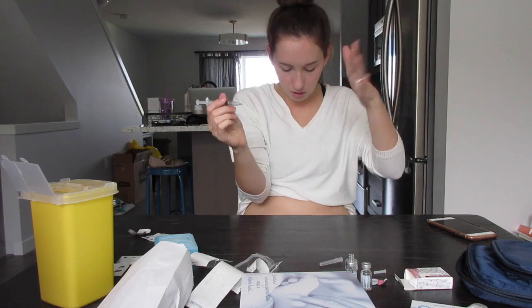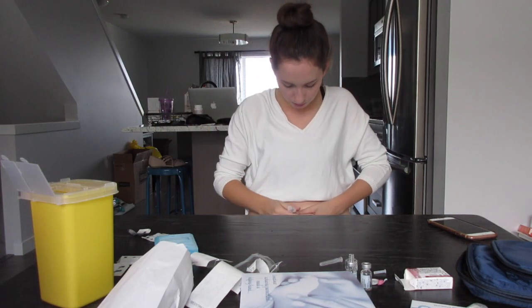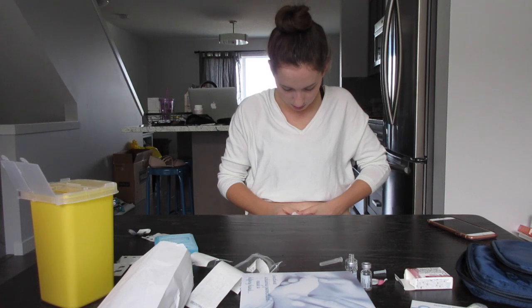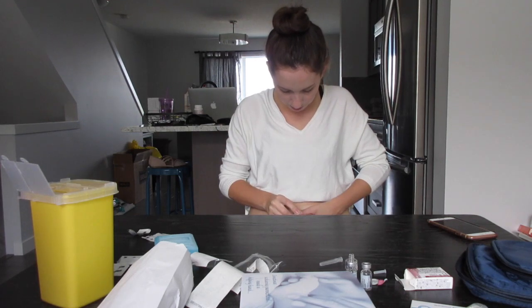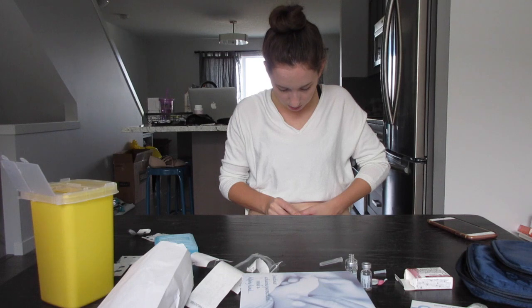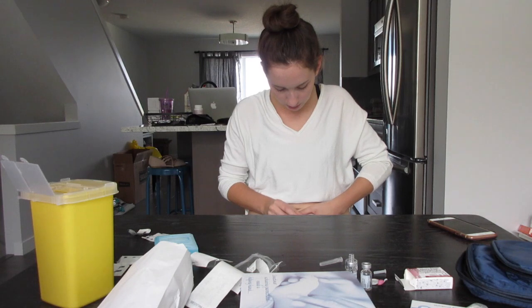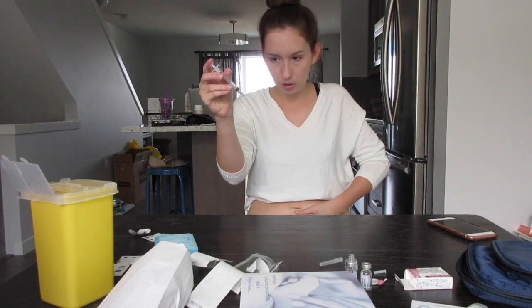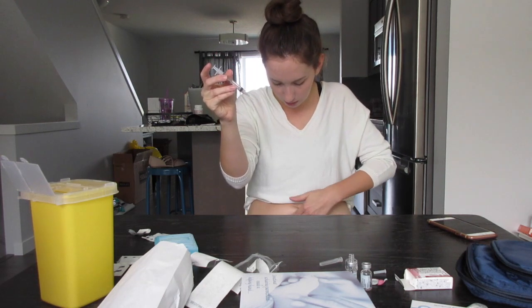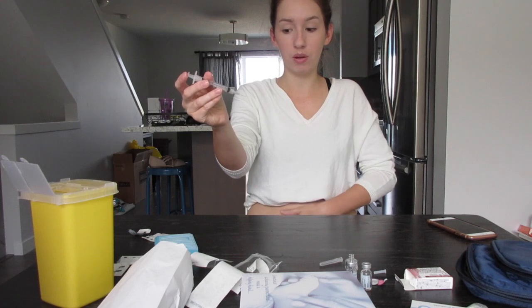So you'll take your syringe, you'll take your other hand and find a chunk of skin. And you're going to place it into the skin and push down. The Menopur I find has a bit of a sting or a burn to it. It is not my favorite whatsoever. It's not horrid or anything, but you can definitely feel it more than the Puregon. So you put it all the way in, you count to five. Like I said, tighten the skin so that the needle can come out seamlessly, and pull. So that is everything. You can even massage the area after to make sure that it's moved around and that it might feel a little less sore later.